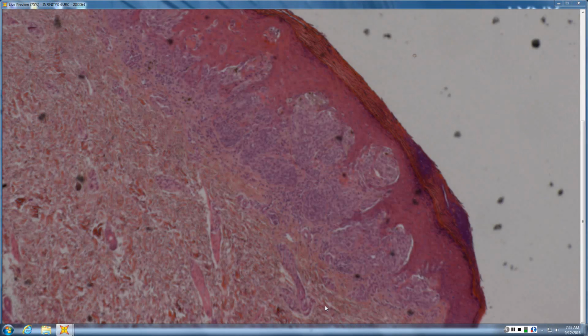Okay, how about that? Off the bat, in the epidermis, I'm noticing some hyperkeratosis and some epidermal hyperplasia, almost pseudoepitheliomatous. Yes, spiky PEH-like hyperplasia of the epithelium. And then I have some bigger nests at the DEJ that look like they're running almost vertically along what's left of the rete. And there's some good clefting in those nests as well. Okay, so you're making a strong case for Spitz nevus.